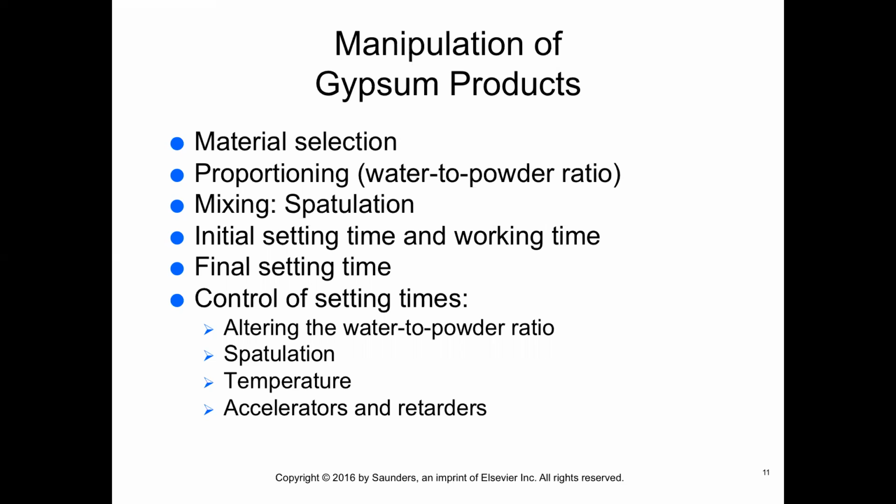Most manufacturers recommend that about 1 hour should pass before the impression is separated from the cast. If the impression is removed too soon, the model or the teeth will break. If left too long, the impression will dry out and will possibly snap off the teeth when you try to remove it. It's impossible to accelerate the final set of a mixture without also accelerating the initial set, thereby reducing the working time.